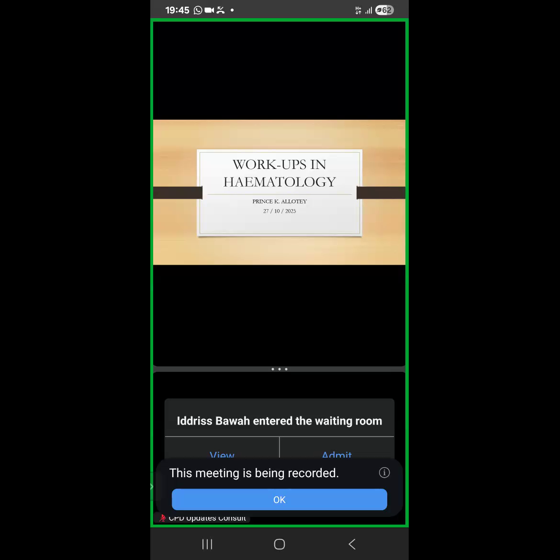It doesn't mean there's an absence of a pathology. The fact that red cells look normocytic, normochromic, the WBCs look morphologically normal, platelets are adequate, doesn't mean there's no problem. There may still be a problem. That is why we need all of these things to bring them on board.